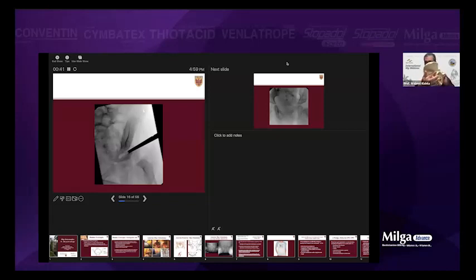When you do the osteotome, the osteotome is usually a half inch, going for one third. So I start at the middle third, and once I finish the cut, I use a little bit bigger osteotome, and I start to go more posterior to do the posterior part. The posterior part has most of the bone, and that's very important. That's why I prefer Dega, and that answers the question for Dr. Ayman, or Dr. Ahmed: if you have posterior deficiency, Dega is very versatile.